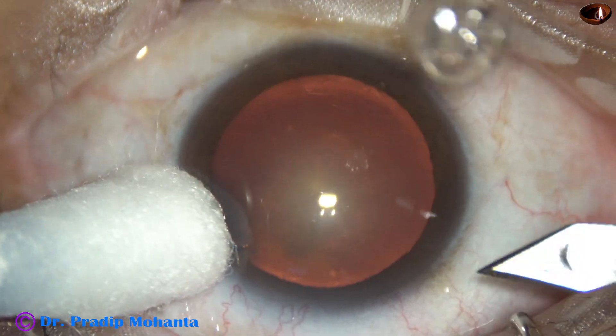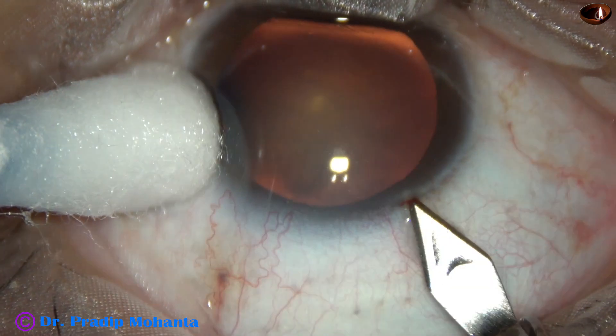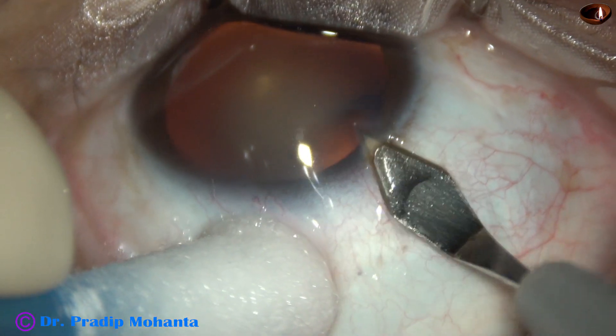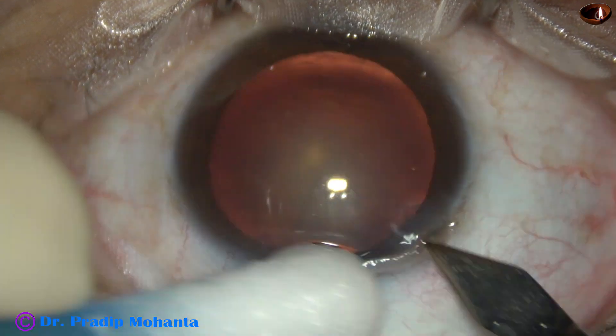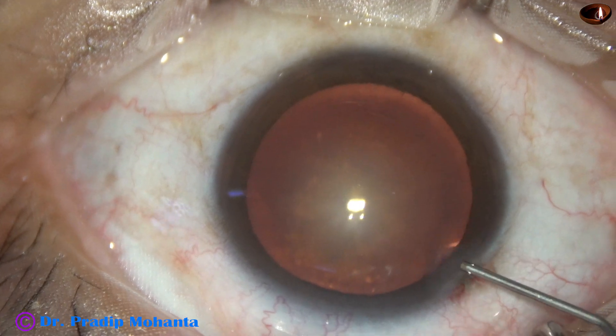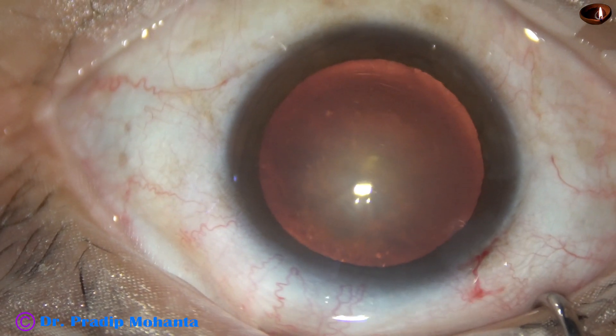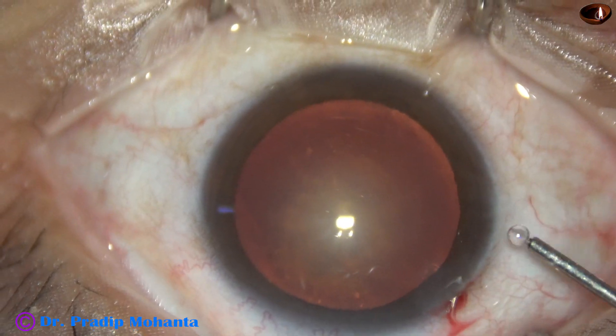The patient is under topical anesthesia. This is the main wound with a 2.8 mm steel keratome on the posterior aspect of the limbus. And this is phenocaine, which contains lignocaine, tropicamide, and phenylephrine.